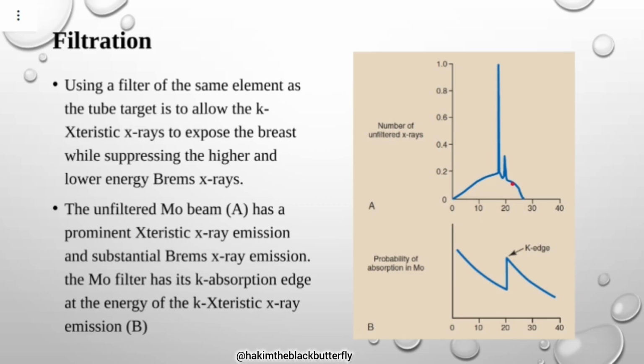Take an example. We have this breast here. It is not compressed. Some tissues, for example at this particular level, are far away from the image receptor. Even this maybe solid tumor here is somewhat far away from the image receptor. And whenever something is far from the image receptor, we get what we call magnification.